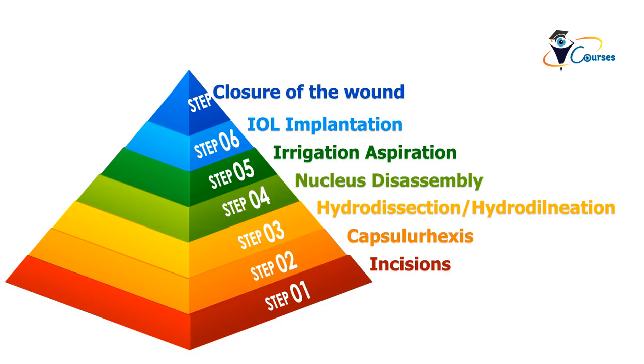Okay, Dr. Islam, does stromal hydration increase the astigmatism? Well, even if it increases the astigmatism, it will be better than suturing. Suturing will definitely change the refractive media of the cornea, but stromal hydration will cause little or no astigmatism at all.